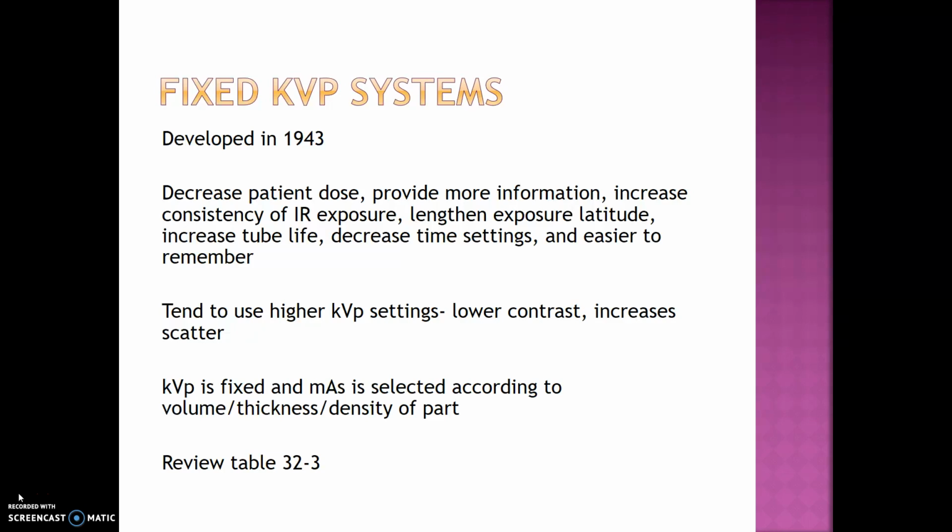Fixed KVP systems were developed in 1943. They decrease patient dose, provide more information, increase consistency of IR exposure, lengthen exposure latitude, increase tube life, decrease time settings, and are easier to remember.